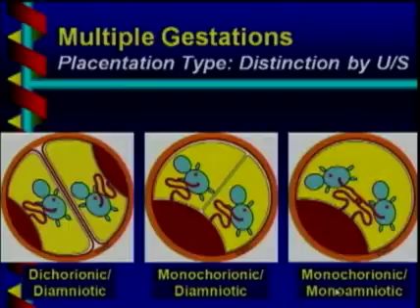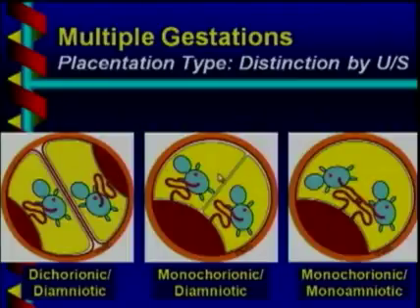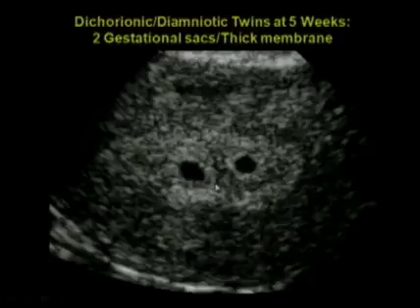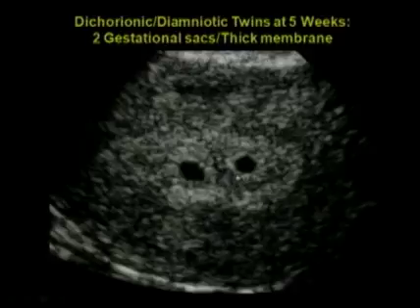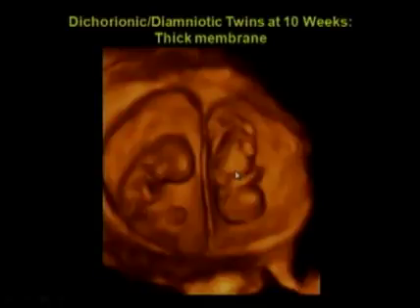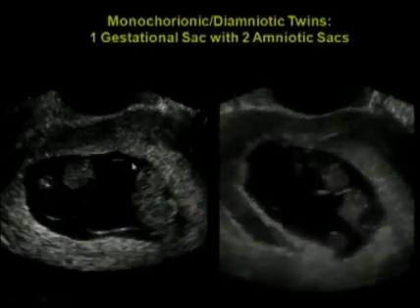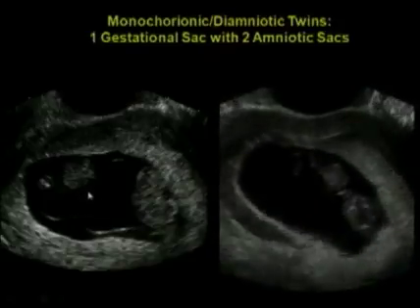These rules don't always work — it isn't always easy to tell di-di from mono-di membranes, as both can be fairly thin in the second and third trimester. Here are di-di twins at five weeks with two separate gestational sacs separated by a thick band of tissue. On a 3D view at 10 weeks, you can see the fairly thick membrane — not the very thin, wispy membrane of mono-di twins, which consists of two layers of amnion only, no chorion.